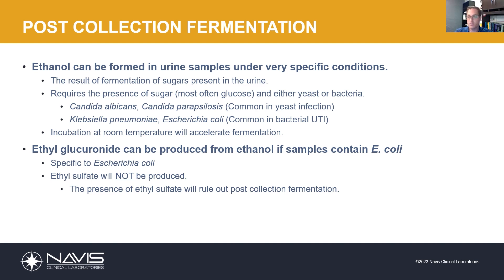In addition to production of ethanol, if E. coli is the bacteria that's present, E. coli is capable of taking that ethanol and converting it to ethylglucuronide, a metabolite of ethanol. Now, this is specific to E. coli. What's also important to note is that ethylsulfate — the other metabolite — will never ever be produced in a urine sample.